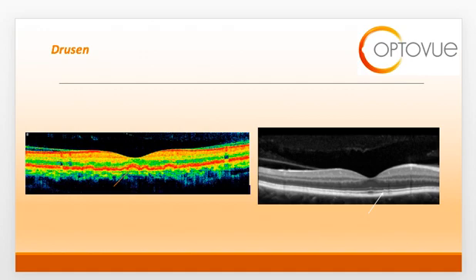On the right-hand side of the slide, you can see an OCT depicting hard drusen. Hard drusen are small with distinct margins. As you can see, hard drusen are barely visible on OCT. However, they can become confluent and result in RPE changes that can lead to exudation.